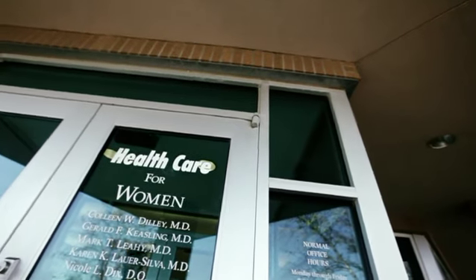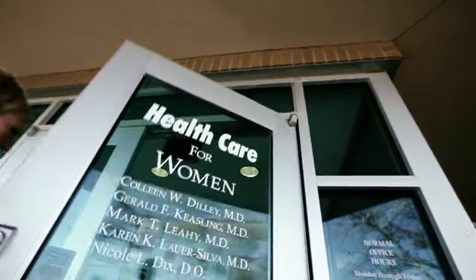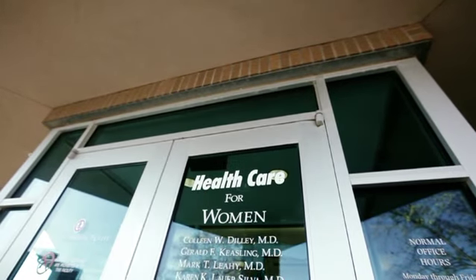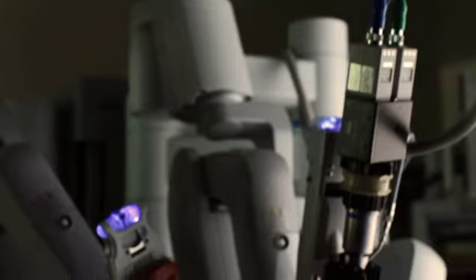At FAMC, the majority of hysterectomies are performed with the da Vinci. Gynecologists on the medical staff are some of the most experienced in the state at performing the procedure.